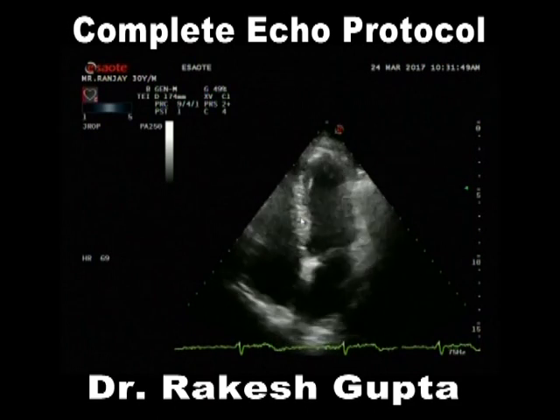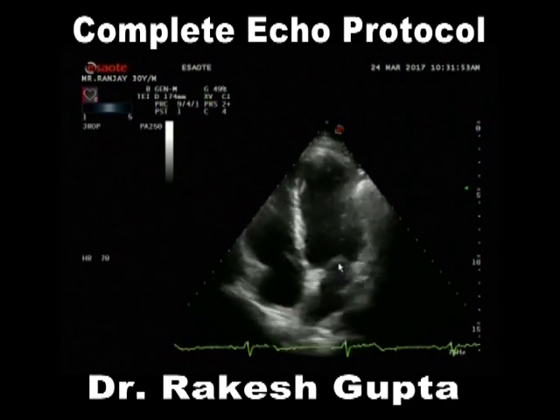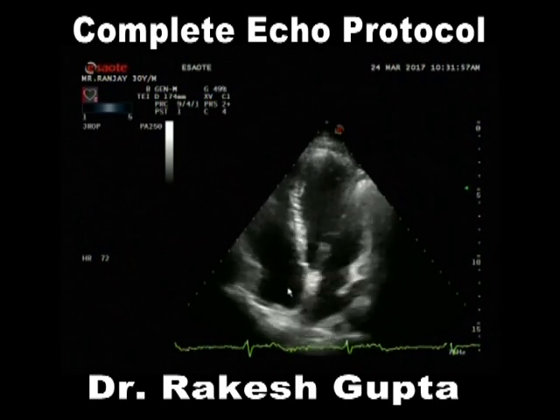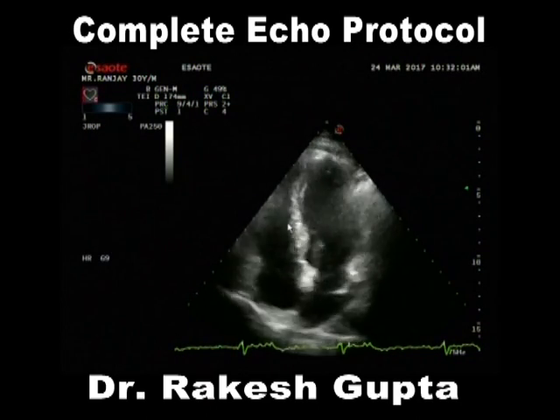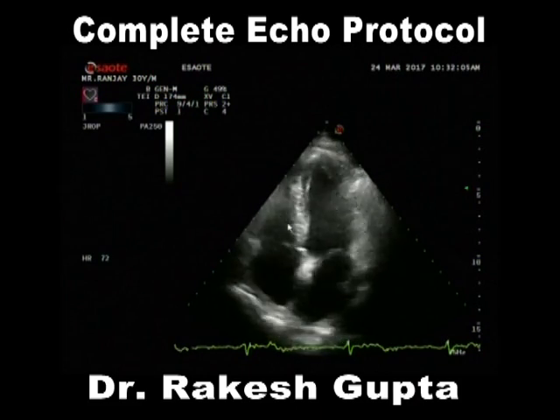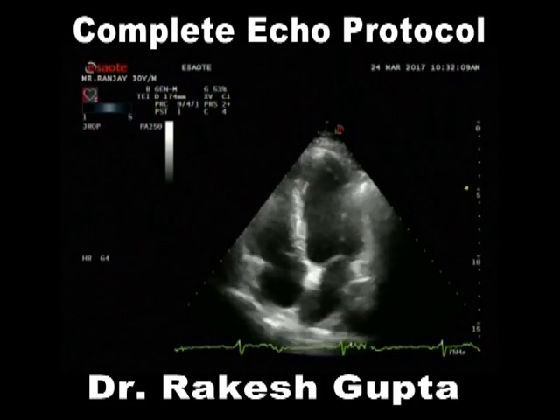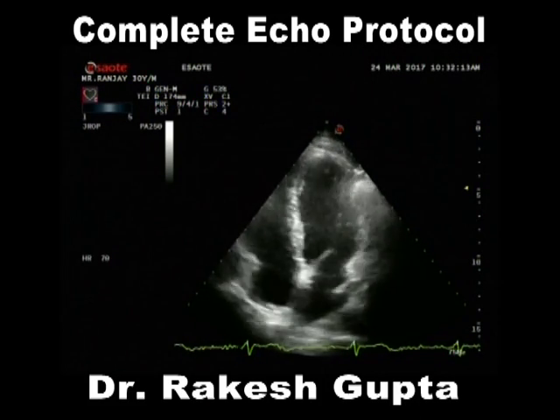We look at the basal, we look at the septum, we look at the lateral wall. Here is the AML, here is the PML, and here is the LA, interatrial septum, and RA and RV on top. Most important thing we require in this 4-chamber view is to evaluate the wall thickening abnormality, and all these wall thickening abnormalities are dependent on good imaging quality.